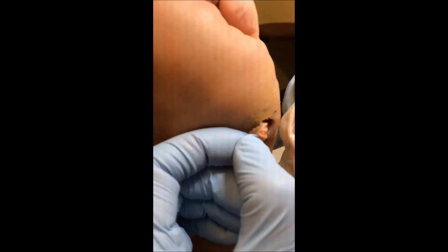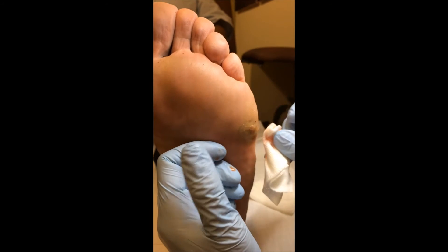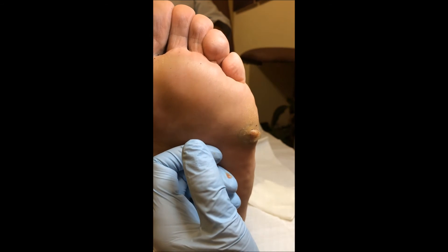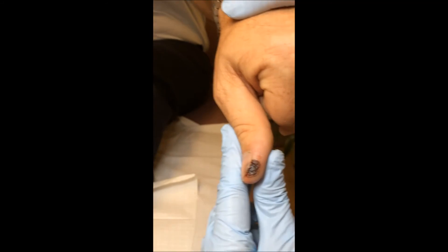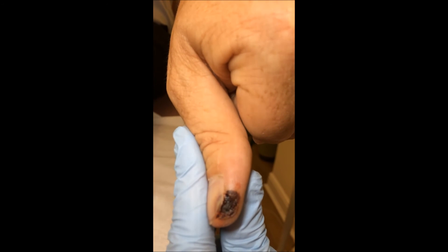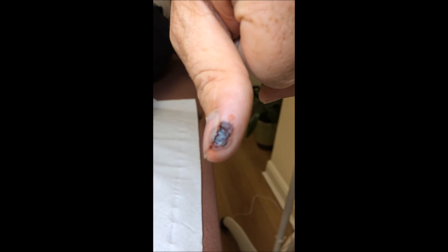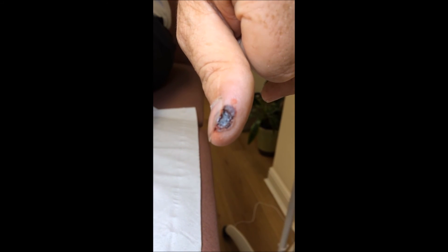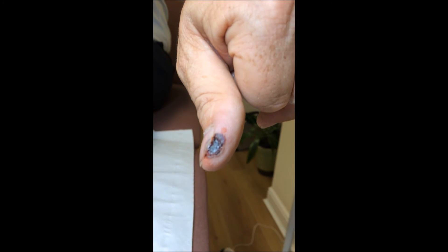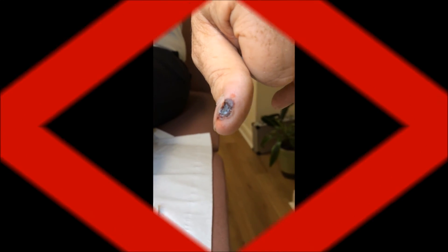While I let that drain a little, I just want to show you the gentleman's thumb wart. This is a periungual wart that just would not go away, right under the nail. We also lasered that the other day and got a nice blister on that. I will not need to do anything with that today, but we do still need to keep that clean and protect it a little bit from any mechanical stress.